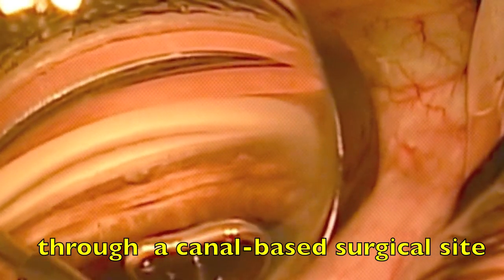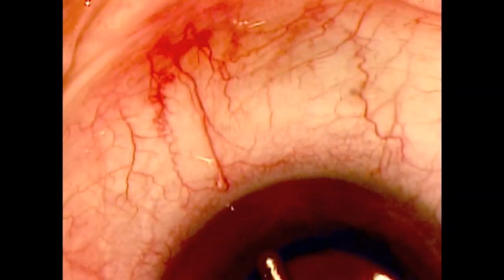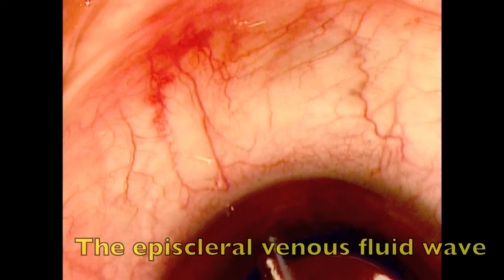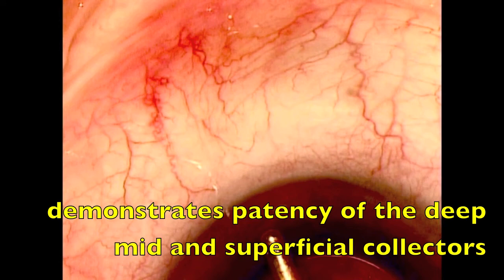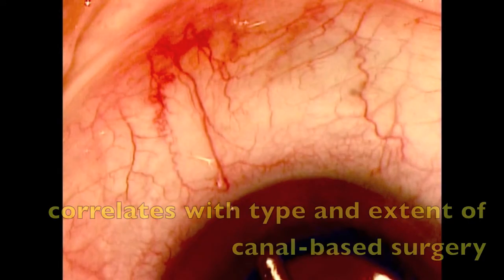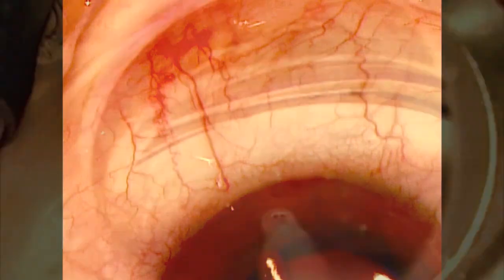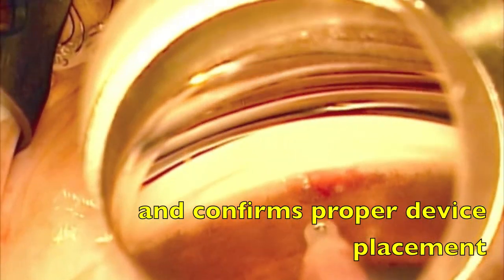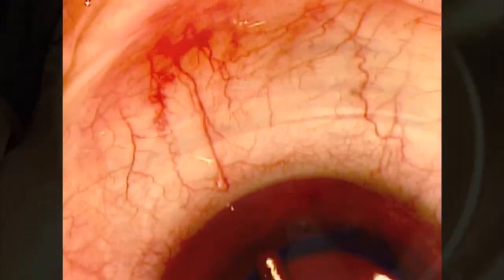As presented at the 2014 ASCRS meeting, the observation of the venous fluid wave demonstrates anatomic patency of the deep, mid, and superficial collector channels, correlates with the type and extent of canal-based surgery, and informs the surgeon of proper device placement.